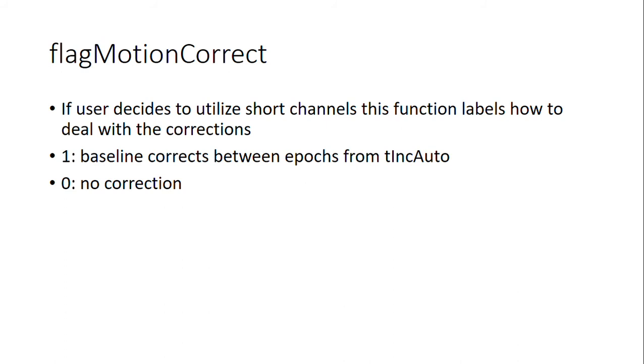So it acts as a corrective function for any motion that may have interfered with your data, and essentially the goal is to make it neutral. So it's not going to just create or destroy any unnecessary data.